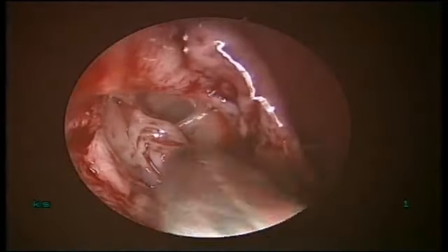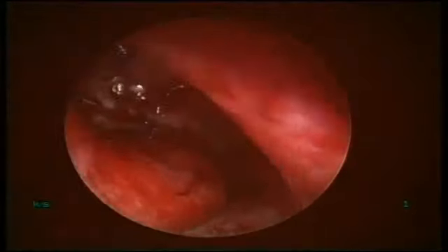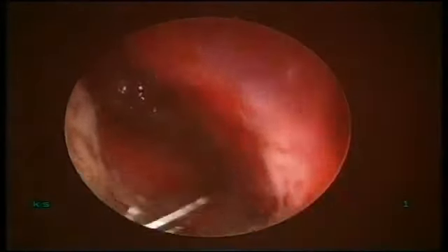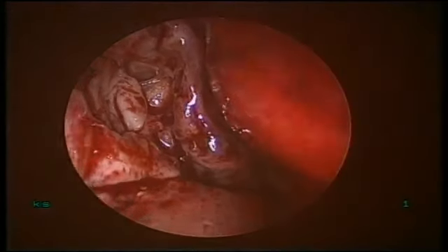And see this. Yes, sir. Nasolacrimal system. Gel foam. So finally I will just reinforce these flaps to their place so they do not fall back. See that? No bleeding. Such cases do not require any nasal packing.